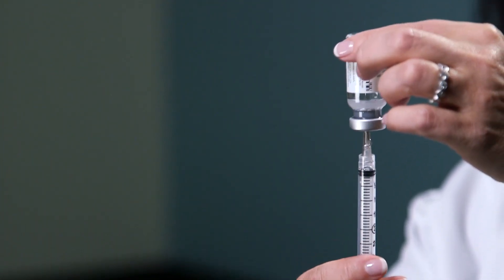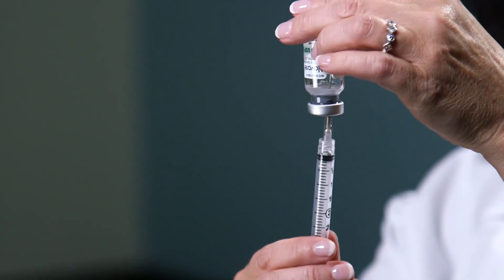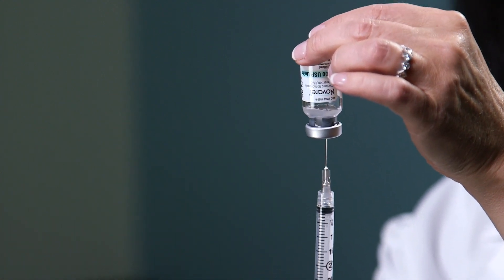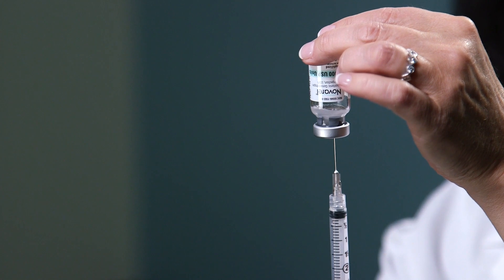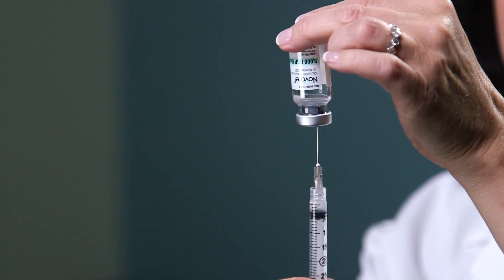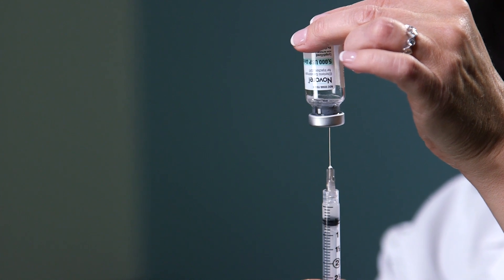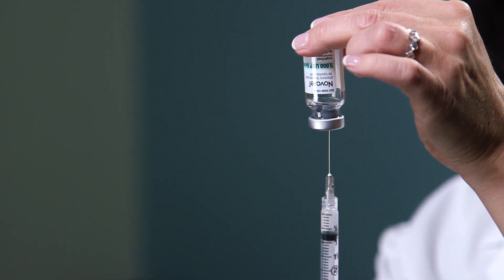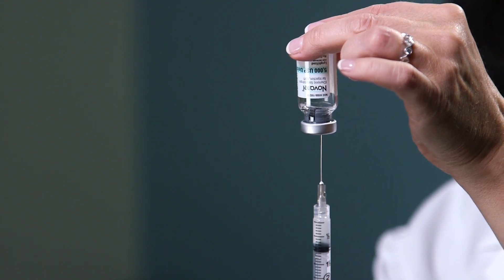Turn the vial upside down and pull the needle down so the very tip of the needle stays within the liquid. It's a very small amount of liquid. Gently pull down on the plunger while at the same time backing the needle out of the vial, so that it stays in the liquid the whole time.